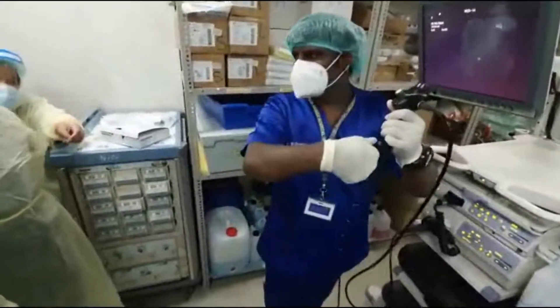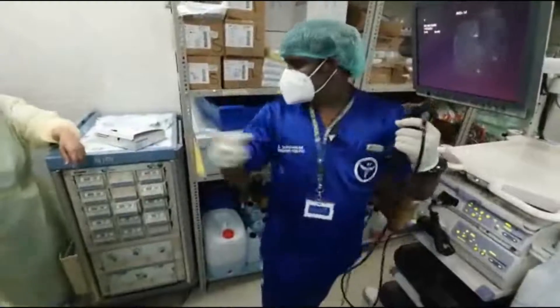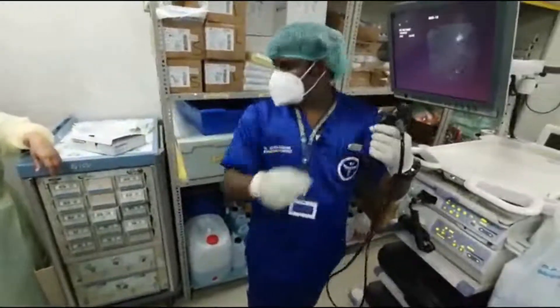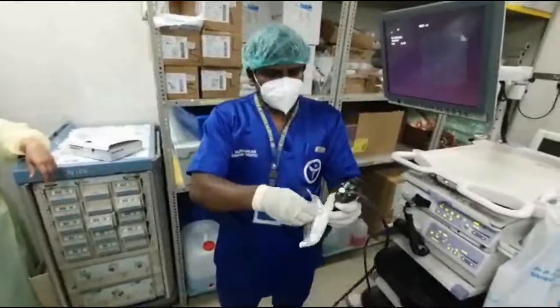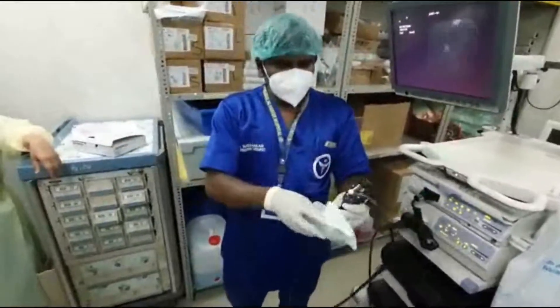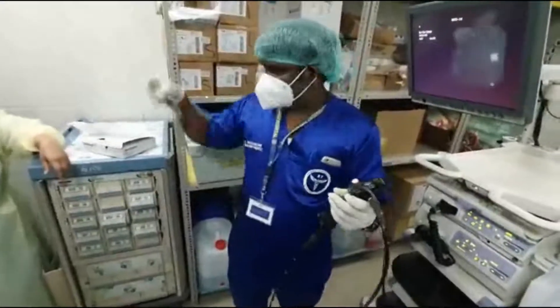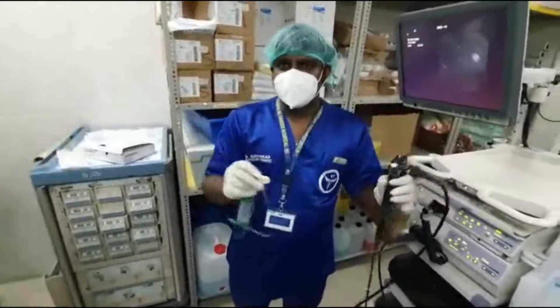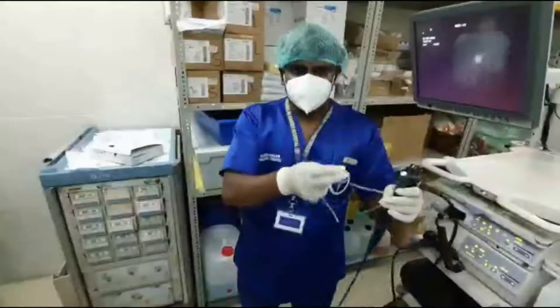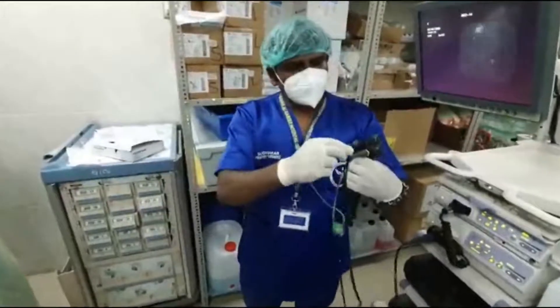If saline is needed, press this saline port here. If you want to connect the BAL valve, take this disposable one — I will show you how to connect it. For demonstration purposes I am not completely sterile; for the actual procedure you must be sterile.